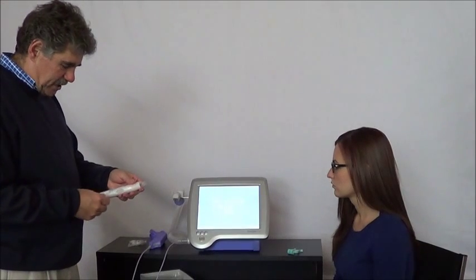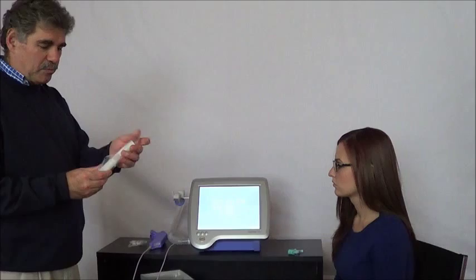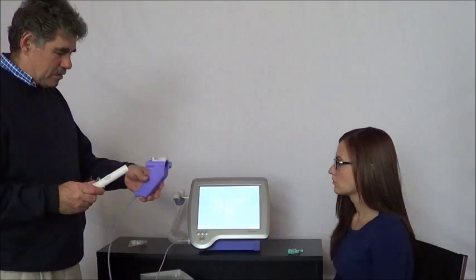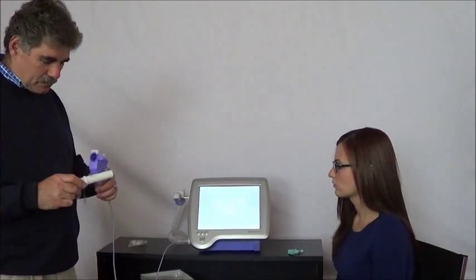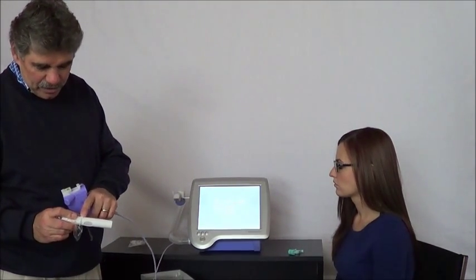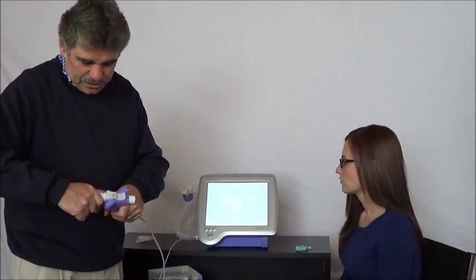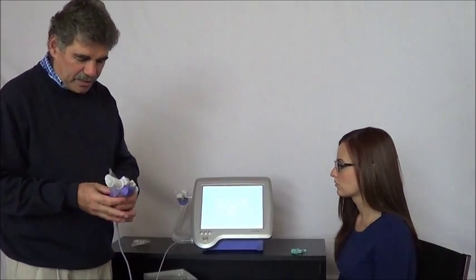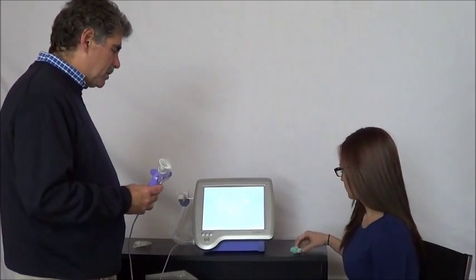To do the SVC test or any spirometry test with this device, we need to use our single patient use spiret and our flow sensor without the valve connected to it. On our spirets, we have a notch or an arrow that matches up with a notch on the sensor, so we're going to install that completely. We'll leave the bag on there for a moment so I can set a baseline. Bianca is going to put on a nose clip.